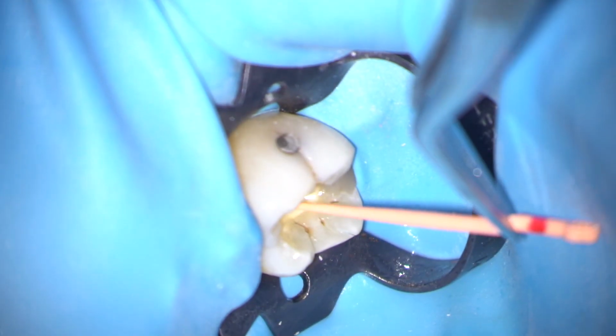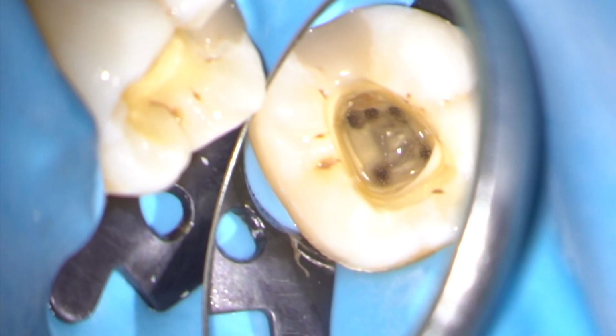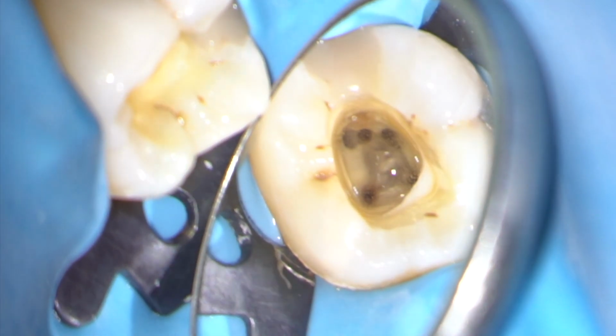I'm carrying out cone fitting in the mesiolingual canal, and you can see that the point glides beautifully to the full working length. And here a nice view under high microscopic magnification of the pulp floor and the 5 root canals in this mandibular right first molar.